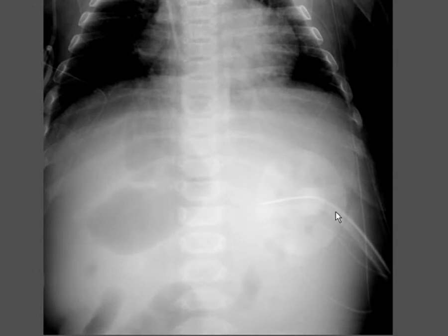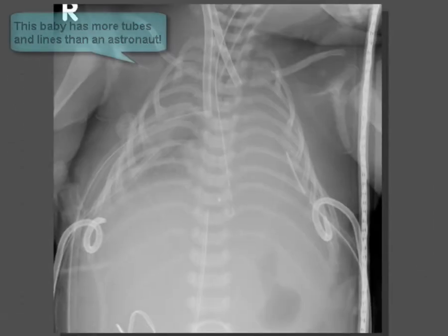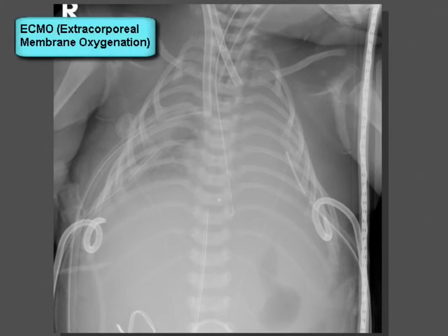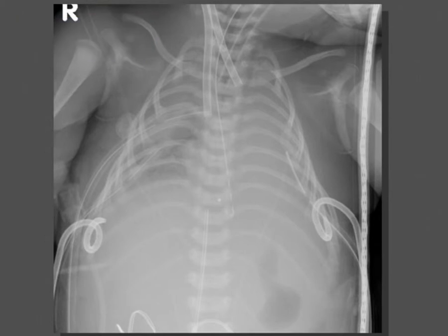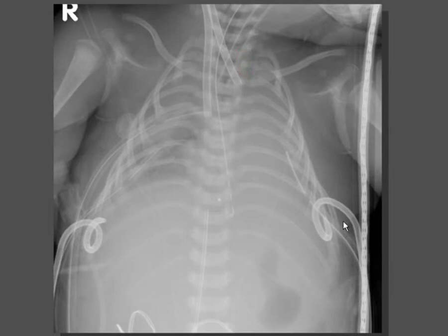Here is an example of a gastrostomy tube — it looks a little like a button with a tube coming out of it. Lastly, we'll talk about other devices in pediatric radiology. ECMO is used as a last resort for respiratory failure: blood is taken out, oxygenated, and put back in. For arteriovenous access, the right common carotid and right IJ are sacrificed. Venous access is placed over the right atrium where blood is taken out and oxygenated, then returned via the right common carotid artery into the aorta and pumped out into the body.